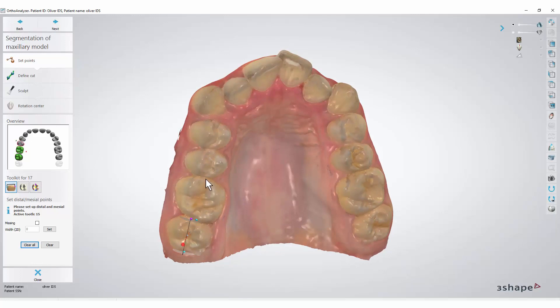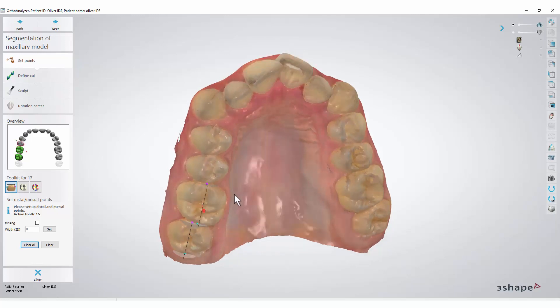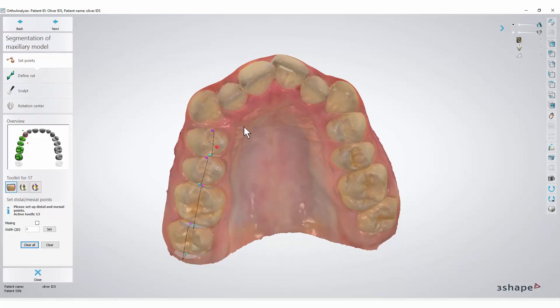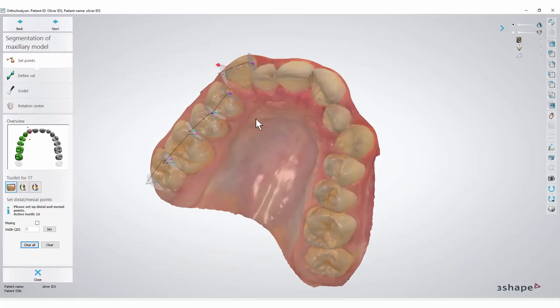Place all the points before making alterations. The software automatically selects the next tooth once the points have been placed. Afterwards you will be able to make alterations to their positioning and the tooth axis.